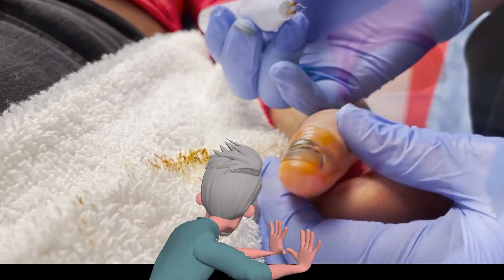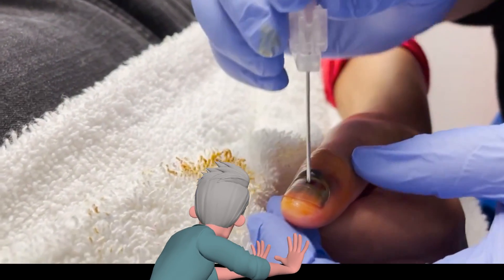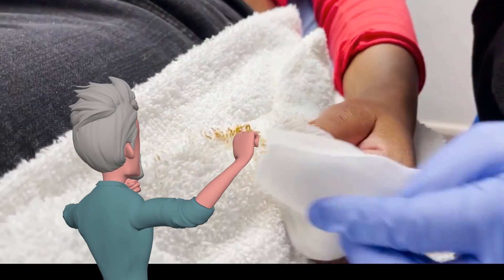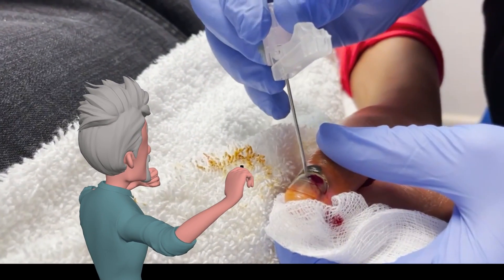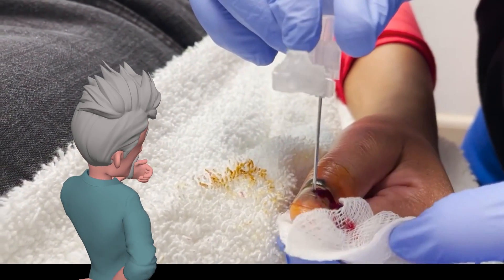Spin it — that just opens your hole up. The important thing is for this to continue draining. You just kind of spin it there. See the blood coming out? It's just to make your hole a little bit bigger.